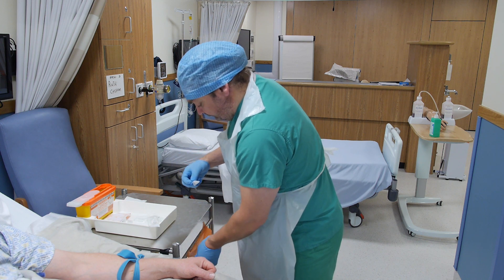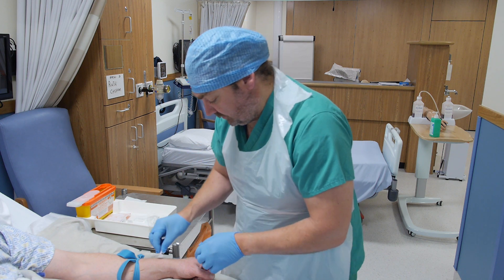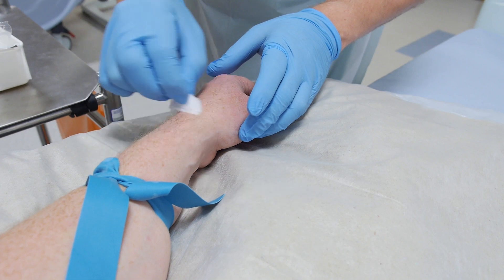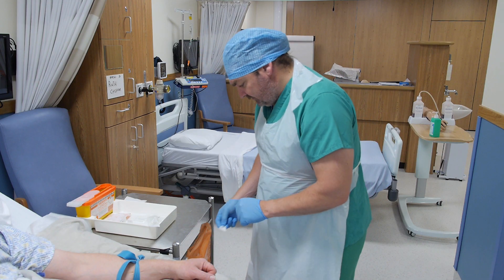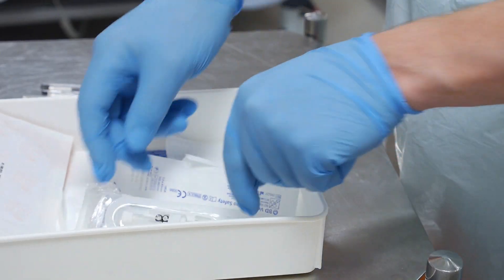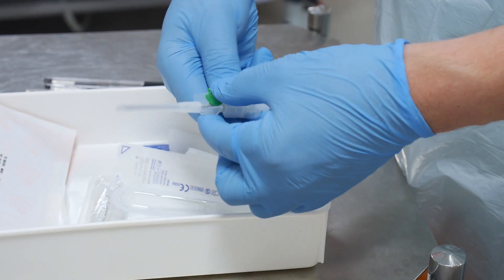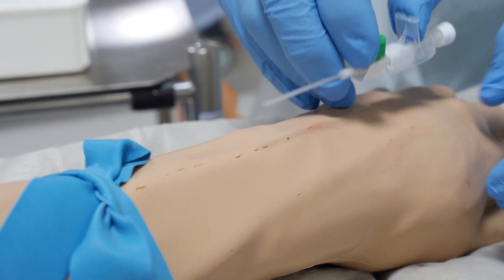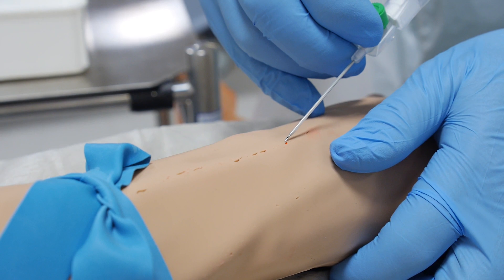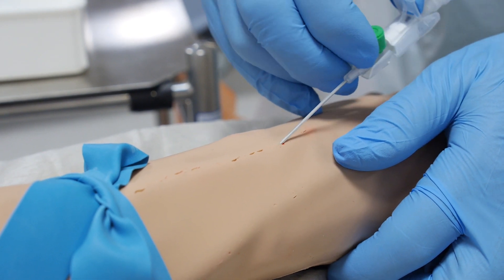Clean the patient's arm over a large enough area to accommodate the dressing. This area should be allowed to dry thoroughly. Do not repalpate the vein. Prepare the cannula and inspect the device carefully, hold it in your dominant hand, align the needle with the vein and apply manual traction to the skin.